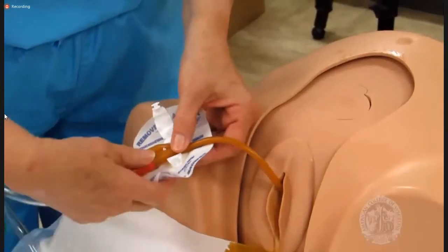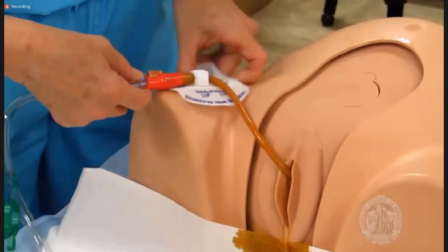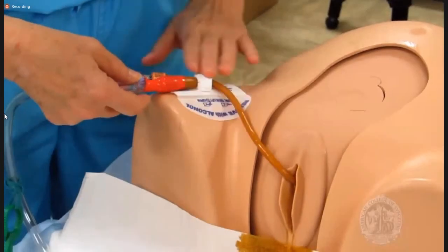Many kits come with a stabilization device. Usually this device has a mechanism to lock the catheter in a single orientation and adhesive on the other side to secure it to the patient. So, like this.